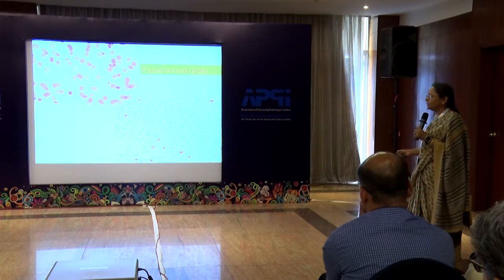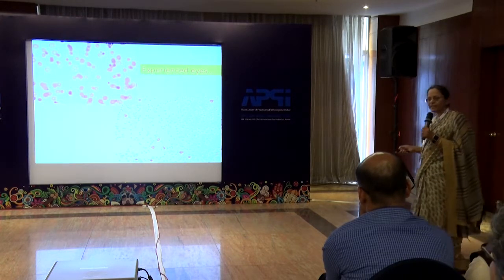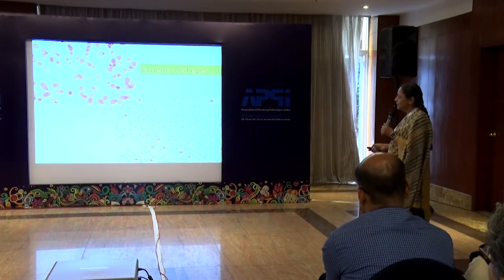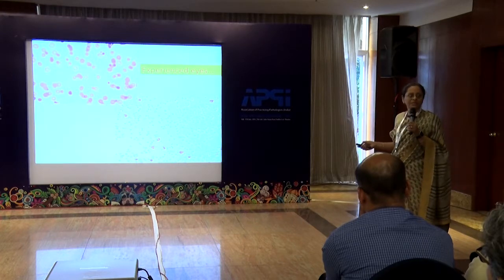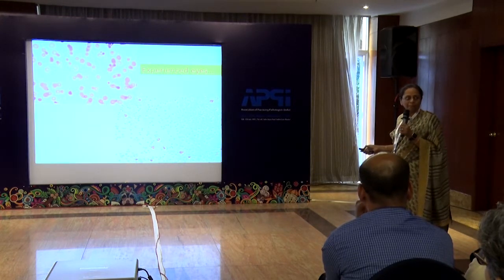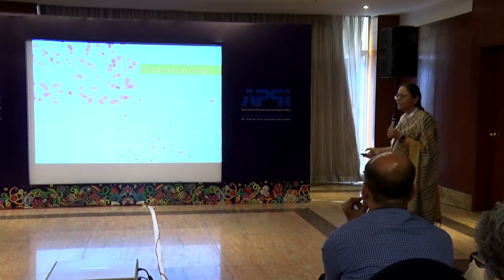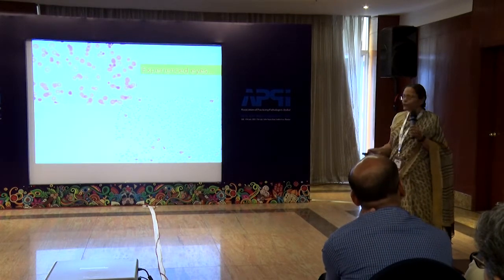Okay, to an untrained eye, that's a trained eye that picked up. To an eye that is trained even further and pays a little bit more attention, there is almost a diagnosis in this. You would say, please do this test. What would you ask for? But osmotic fragility is only going to tell you that these are, yes, spherocytes. It's not going to tell you the diagnosis. What would you ask for?